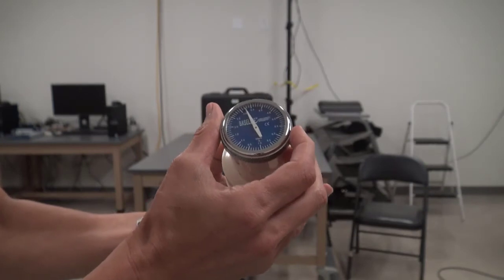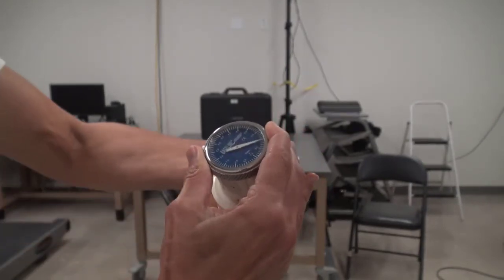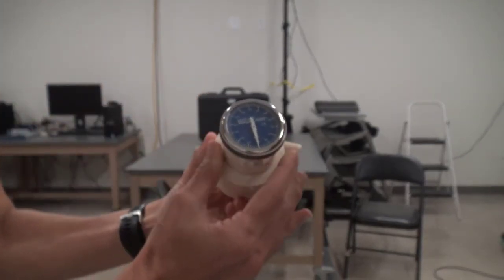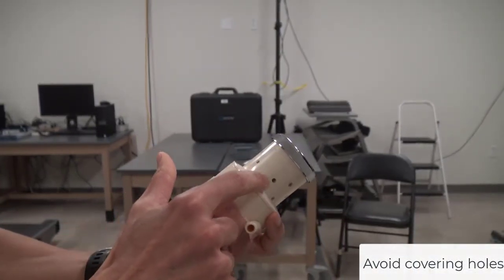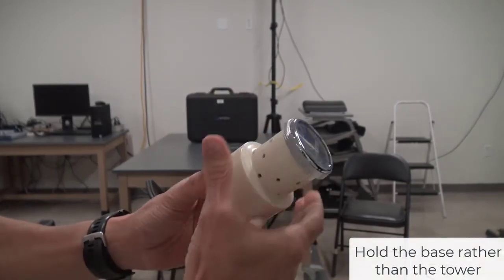When resetting the 0, just grab the spirometer at the base with one hand, and with the other hand twist the cap until the dial meets the 0 or the 7. The 0 and the 7 are the same thing. Be sure the holes are not covered when measuring, so we don't want to hold it at the tower here. Preferable to hold it at the base.